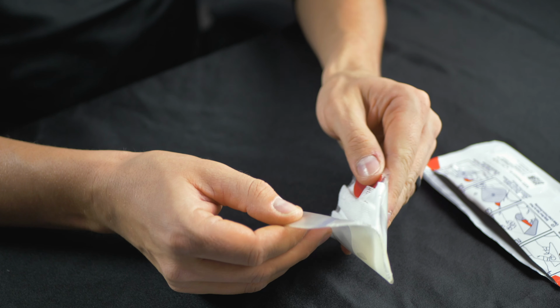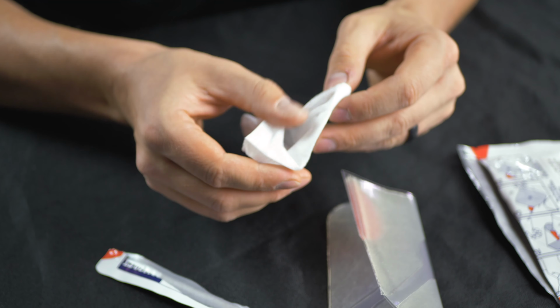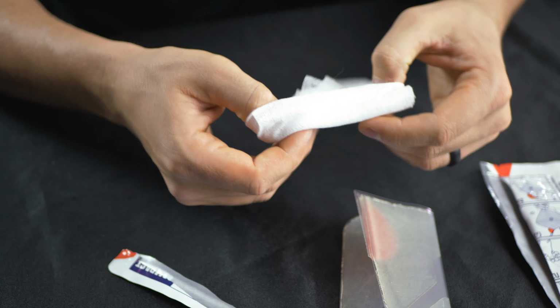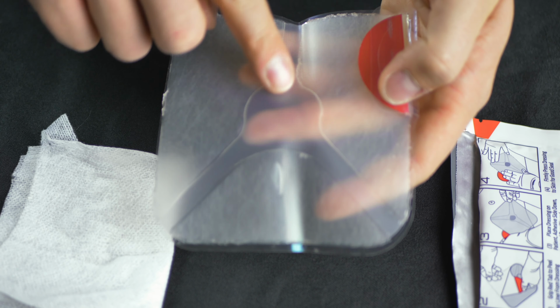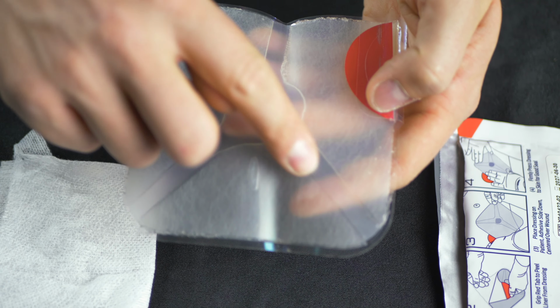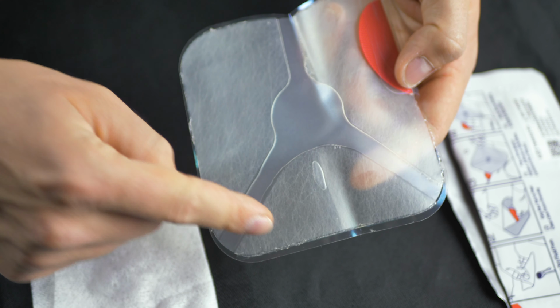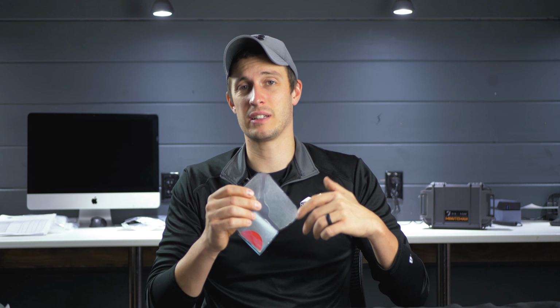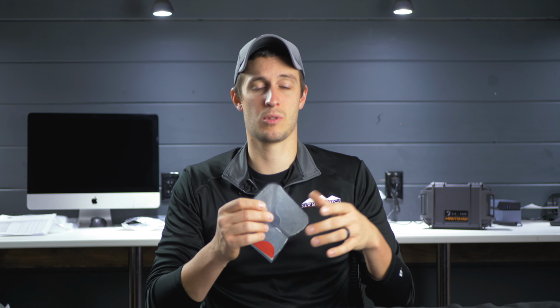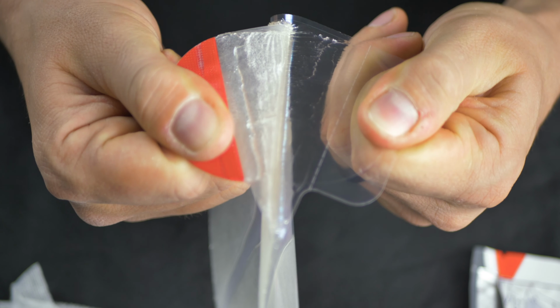I'm gonna open this up. We've got a 4x4 gauze in here. This is to wipe sweat or blood off the chest, so we have a better chance of this sticking to the chest. Now you'll notice here we have our 3 vents. These vents allow the air to escape, but when you take that breath in, this plastic in the middle will suck to the chest. And then we also have these 3 sections of sticky goo that allows it to stick to the chest. These still stick pretty well even if the patient is sweaty or has some moisture on them, but you do want to try to get as much of that off with the 4x4 beforehand.